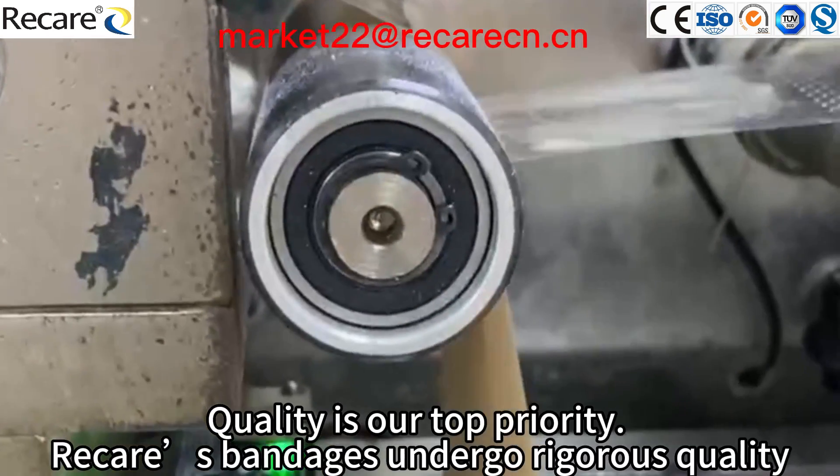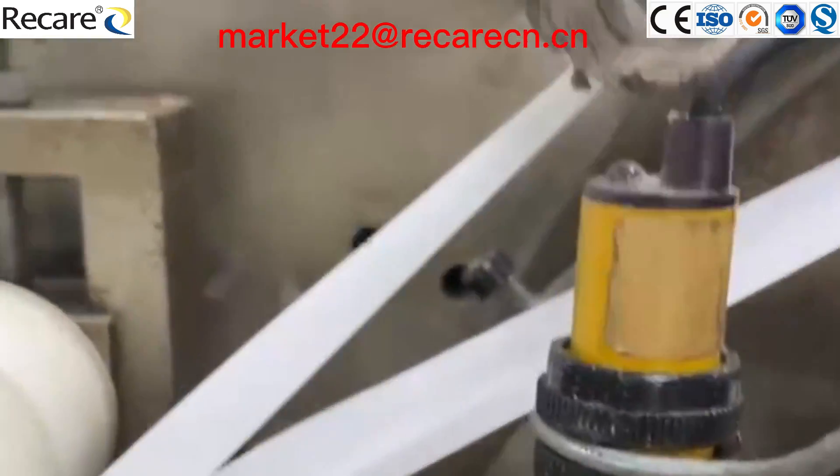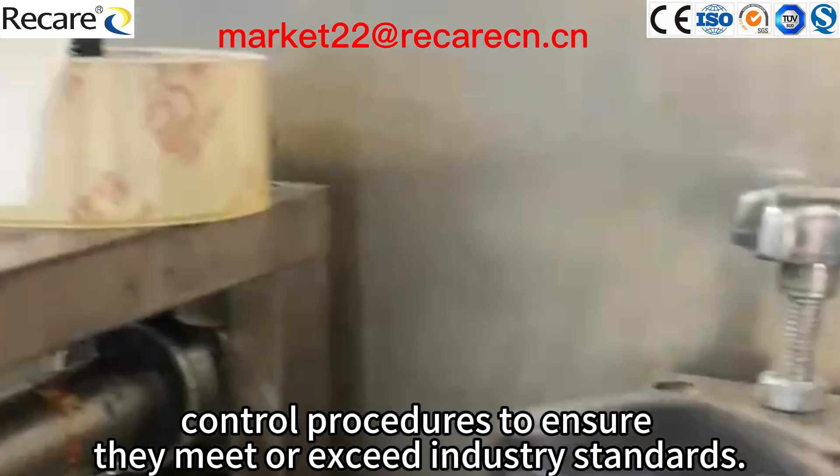Quality is our top priority. Recare bandages undergo rigorous quality control procedures to ensure they meet or exceed industry standards.